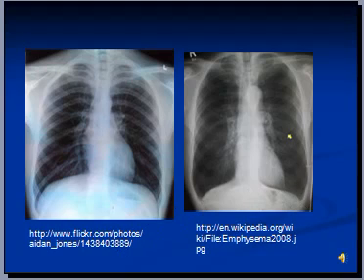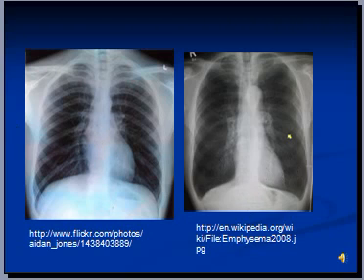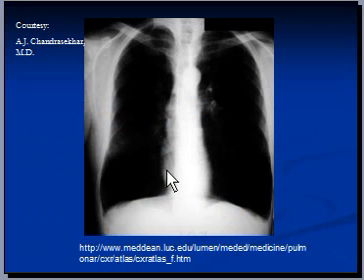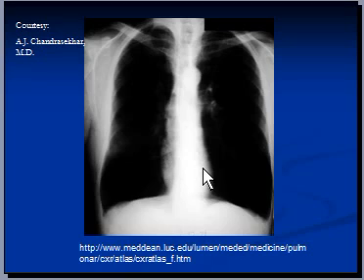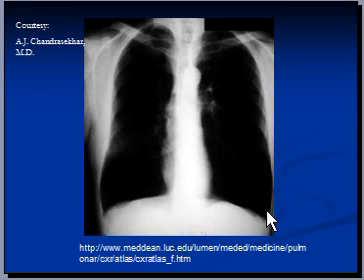Another feature is the narrowing of the transverse diameter of the heart. This is very clearly visible in this x-ray: the lungs are hyperinflated, they look darker than normal, and the diaphragms are flat — a very classic picture of emphysema.